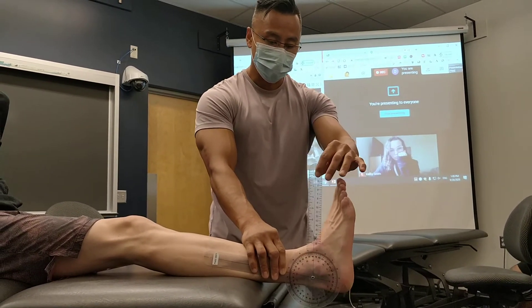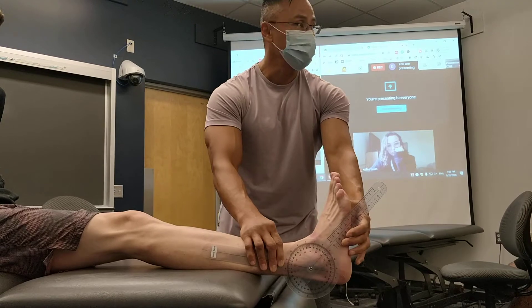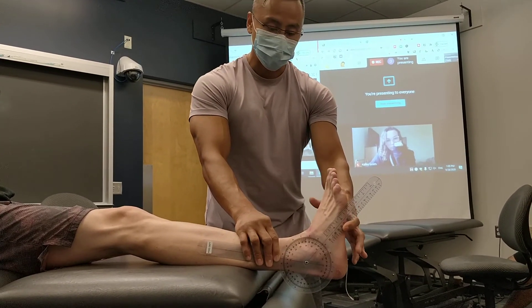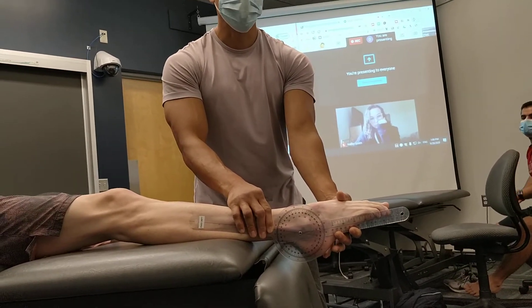Or if you want to reset, let's get back to perpendicular. It looks perpendicular — hold it there, patient. We're going to move to there. Again, that's the adjusted zero. Then plantarflex all the way. So the difference between the first number and this new number is the total amount of plantarflexion.